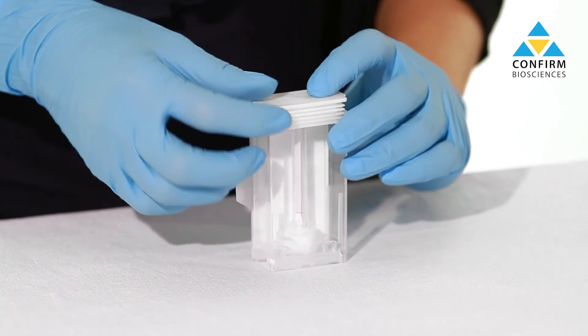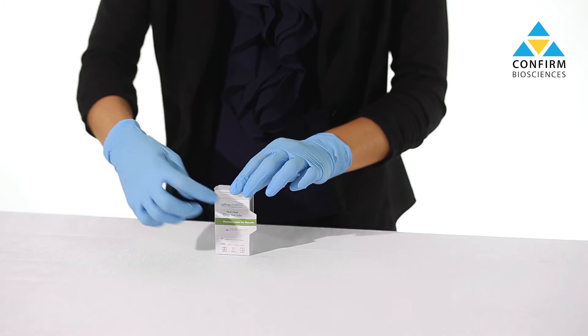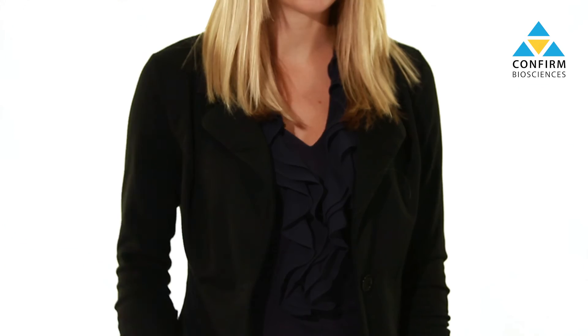Press down completely and keep the test vertical. Peel off the label to reveal test results. Alcohol tests will be viewable at two minutes and drug tests after approximately 10 minutes.